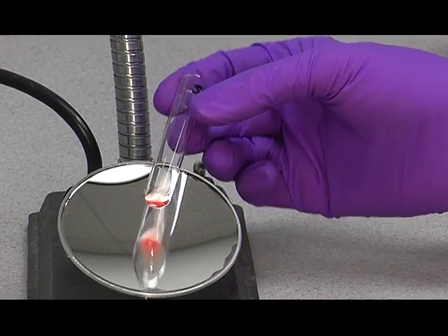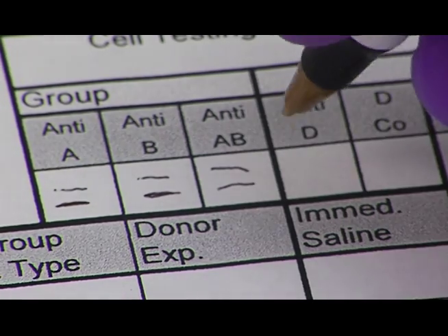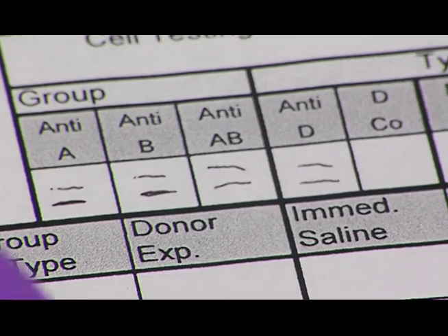You can see that the button now is off the bottom of the tube, and it's a nice smooth reaction. So you see this nice smooth reaction there, that's a nice negative. And record the result for your D-tube.